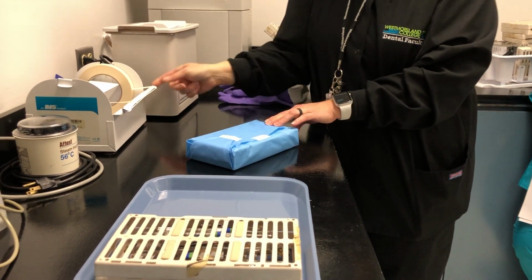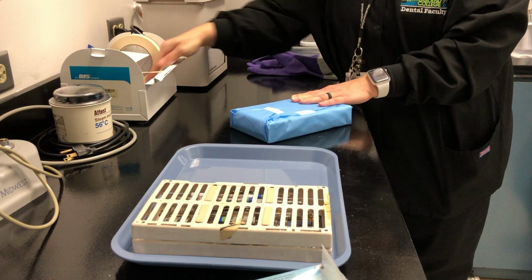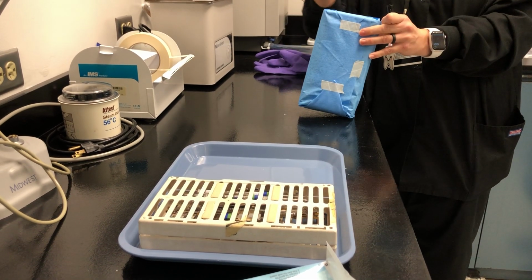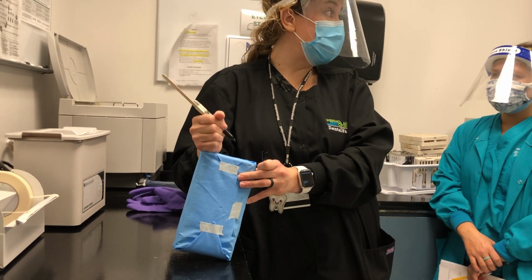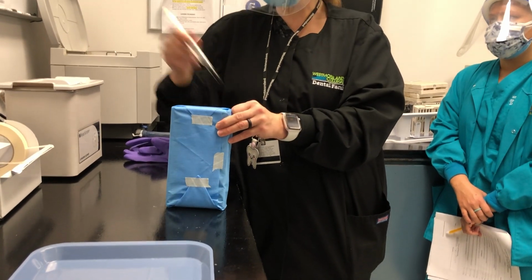So we'll just say that for today's purposes, we will just label them. We could do DA, dental assisting, and your last name. You could just make something up, Merry Christmas. But I just want to make sure that you label it, okay? So you get the gist of that.